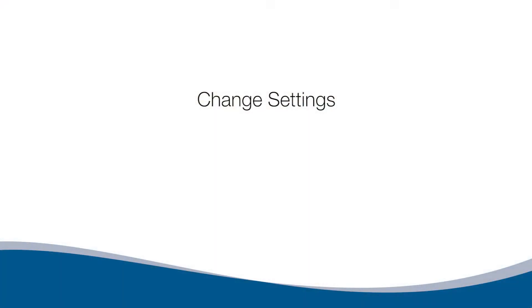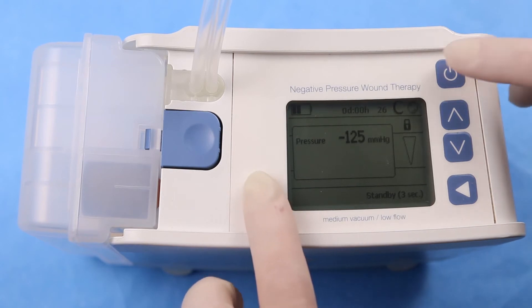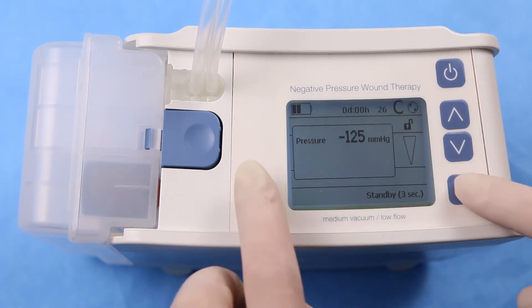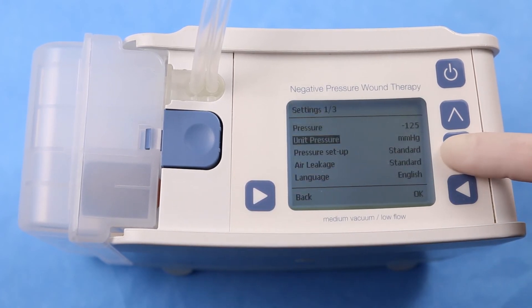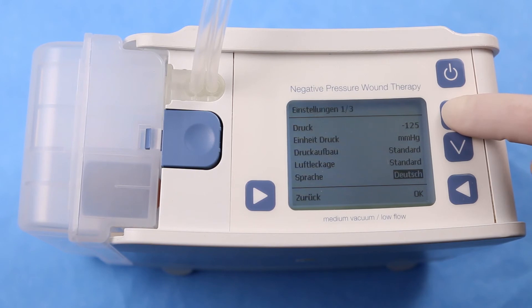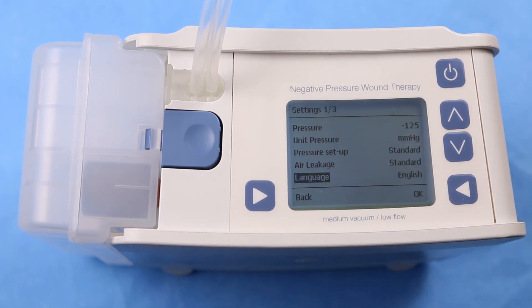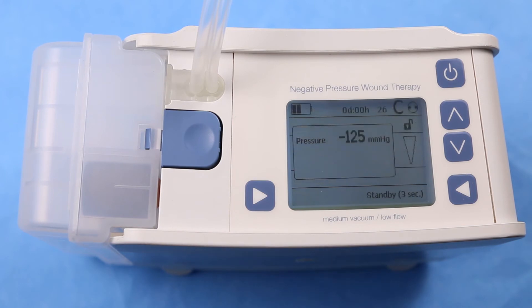Change Settings. The Envia Liberty pump must be in Administrative Mode to change settings such as Pressure Setup, Unit Pressure, Air Leakage Volume, Language, Time Zone, and ON/OFF times for Intermittent mode. To enter Administrative Mode, press and hold the bottom left button and press the top right button, then press the left and right arrow buttons at the same time. Use the up and down arrows to make a selection and confirm by pressing OK. If a change is not confirmed with OK, the pump will revert to the original setting. Press the back button to exit the Settings screen.